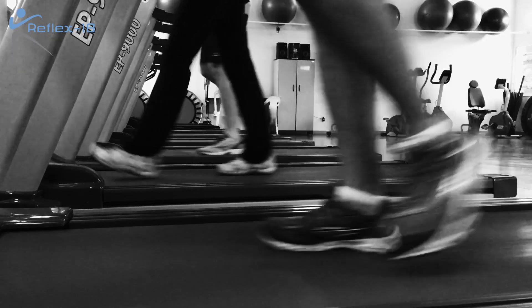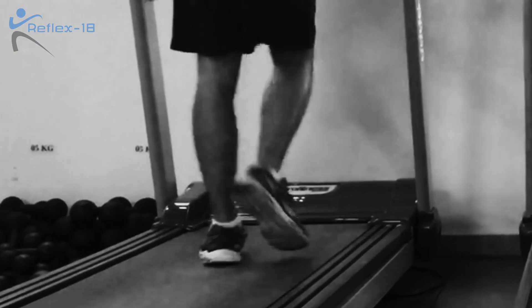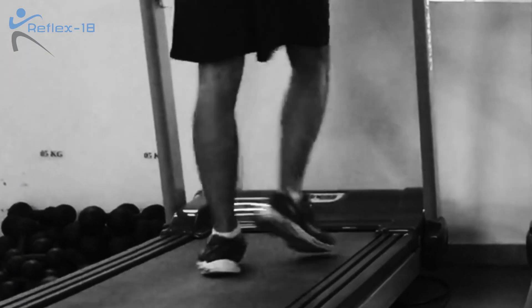When you come into clinic you'll be given an hour-long appointment. At this appointment we'll do a full physiotherapy assessment looking at how your back, hips, knees and feet move. After this we'll do a video analysis of you running or walking on the treadmill to pick up on anything obvious that we can see visually.